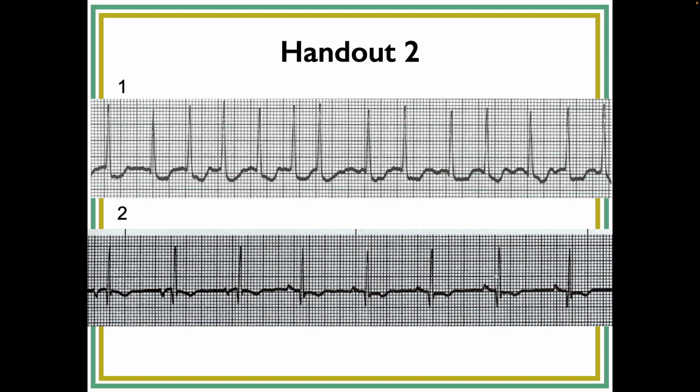So what's that rhythm where the morphology of the P waves changes? That is the WAP. Yes, WAP. I think it's pretty clear to everybody that there's two different morphologies. If you look on the criteria slide, it'll say you have to have three different morphologies, right? And we could argue about, is this a different morphology from this? I don't know. We definitely have two. Do we have three? Point of argument.